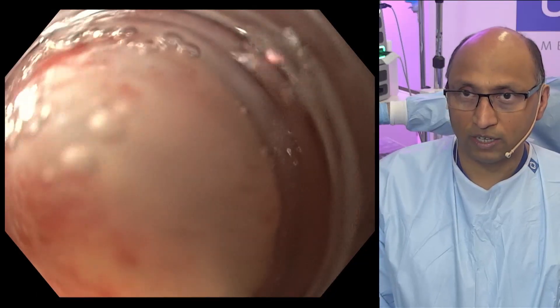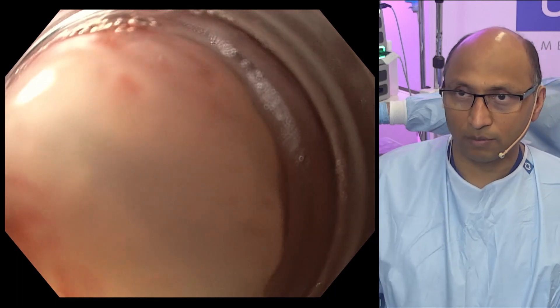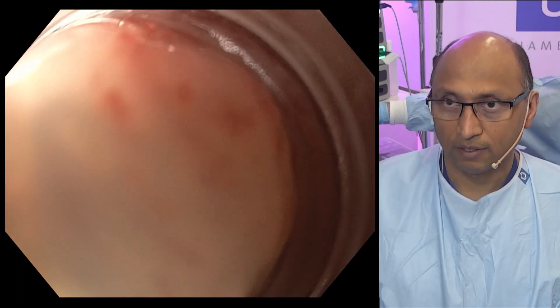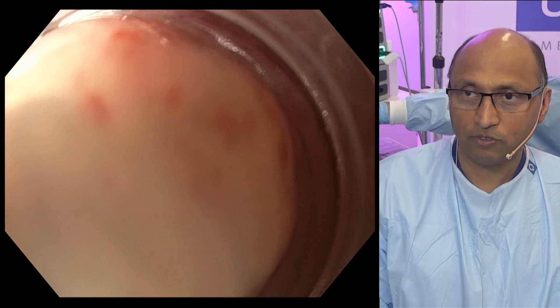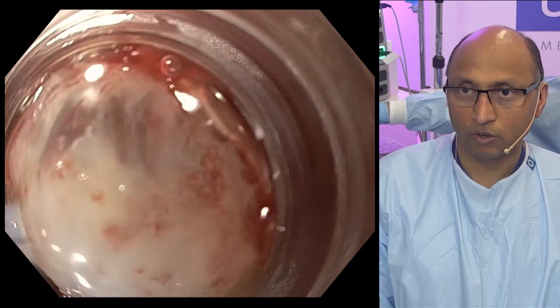Now I think we got most of the lesion in there. I'm not very happy with that — okay, start closing there please. Close, close, close, close. Have you got resistance? Yeah. Good.